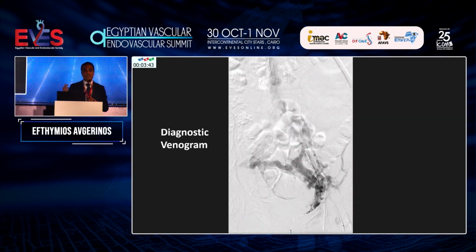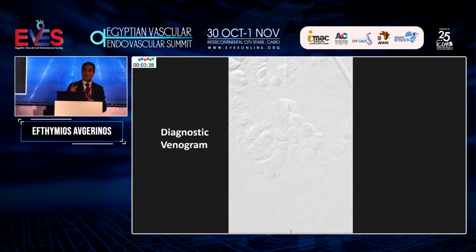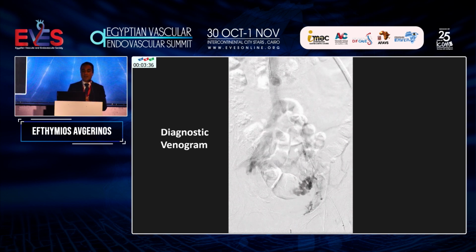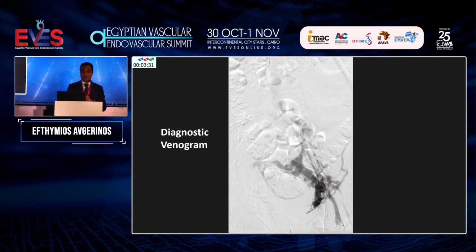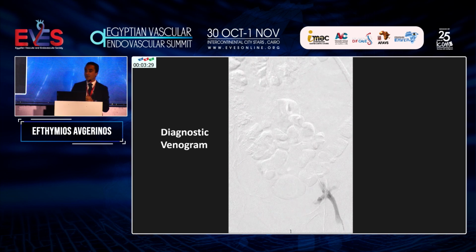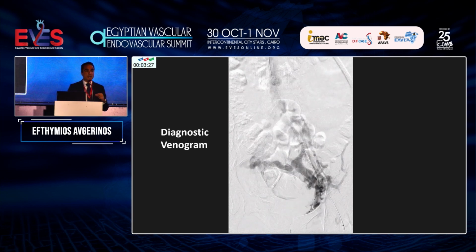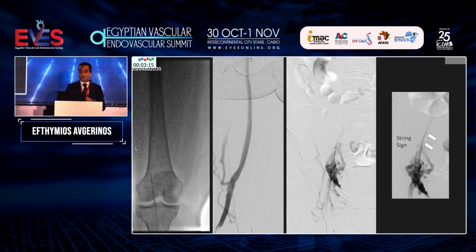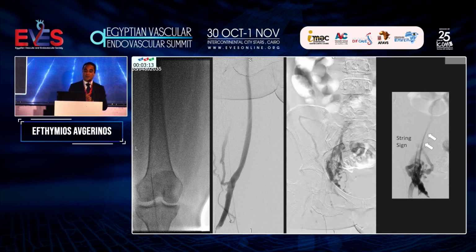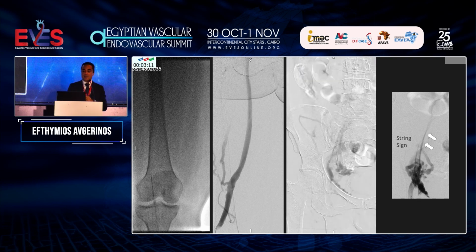Now, before doing this, at that time, I did not have a reliable CT venogram. So for diagnostic purposes, I performed a venogram puncturing the femoral vein. So you can see the multiple collaterals indicating the severe disease across the iliofemoral segment. So another day, I bring the patient back, place her in the prone position, accessing the popliteal vein. You can see a widely open femoral vein. But when you go higher, look at the common femoral vein, look at the external iliac vein, they are out.